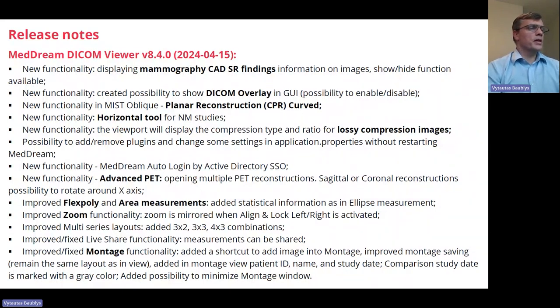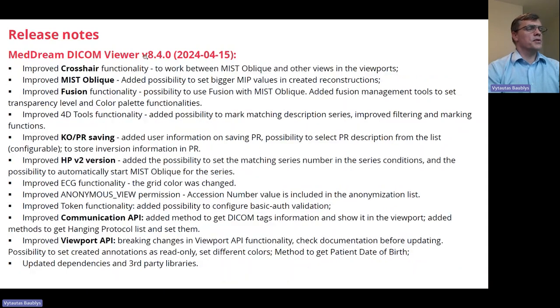But as you see, the list of the functions which were upgraded or created is really significant. And later on, you will see my live presentation. The functions created are really amazing, and I believe for many of our partners they were awaited for many years.